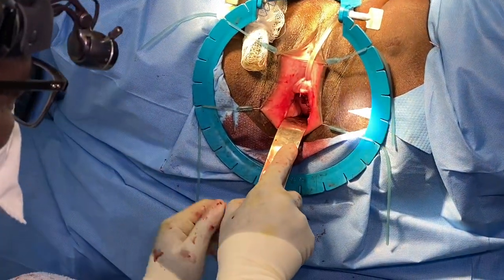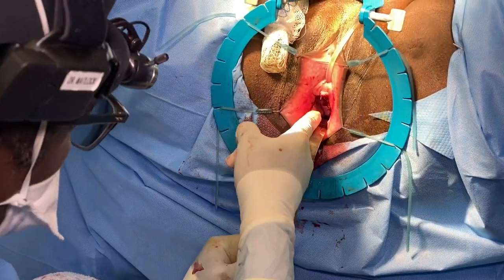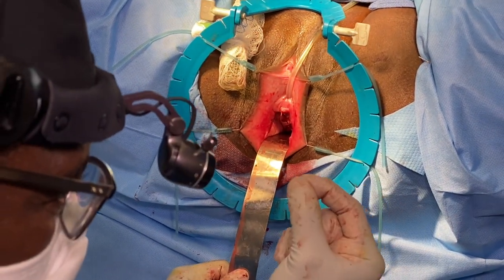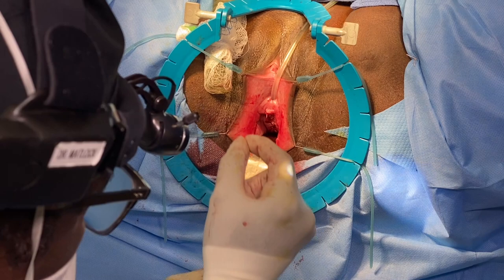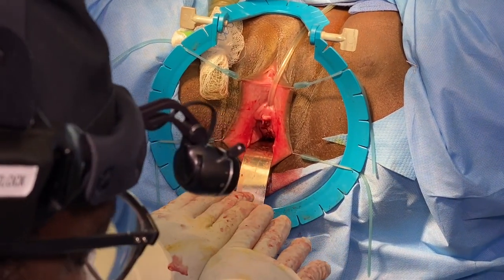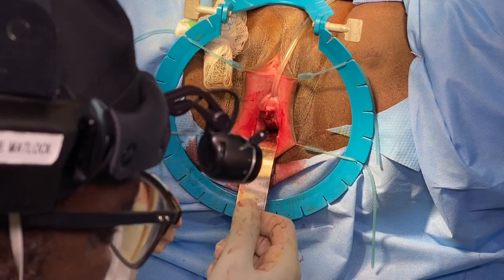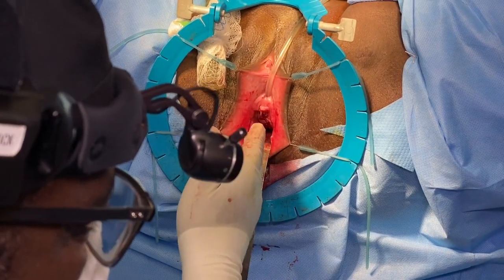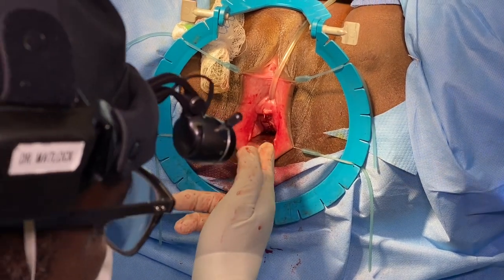Okay. The entire front wall is reconstructed now. We brought the fascia back together, fascia muscles, if you will. Think of it as muscles, but it's all the fascia up the top. Brought that back together, tighten it, it will heal together. We resected the excess mucosa and closed that with an absorbable suture. So everything is corrected now for our stress incontinence and for our complete support anteriorly.